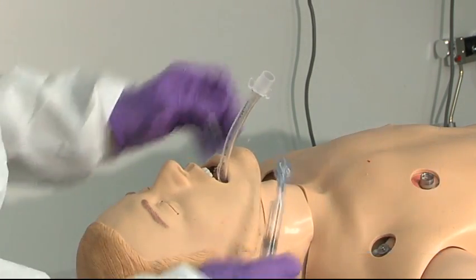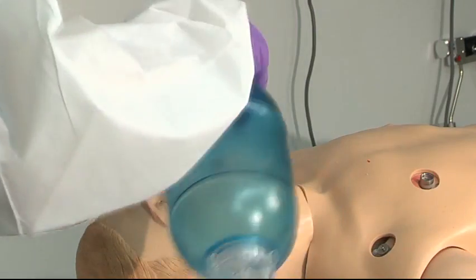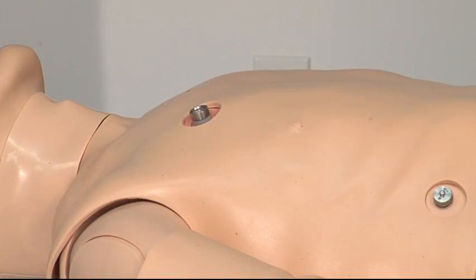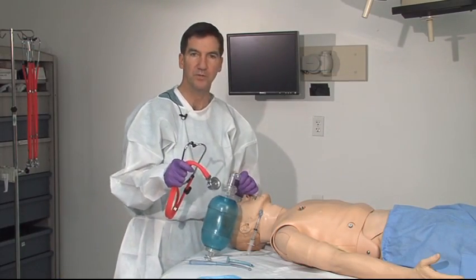Stylet comes out, cuff is inflated, and patient is ventilated. Watch for rise and fall of the chest, and then auscultate to hear breath sounds on each side with no borborygmy.